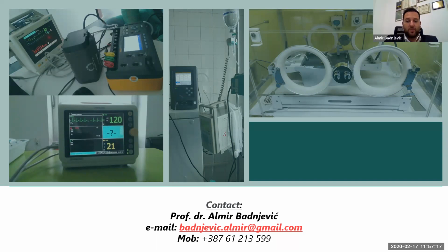Thank you for your question. Yeah. When we started developing those procedures and the bylaws, for example for ventilators and anesthesia machines, the people who were working on this checked all of those service manuals, and they said all the mechanical ventilators have flow from this range up to this range with this accuracy. All of them have volume from this range to this range with that accuracy, and they put it into the law, the bylaws and the procedure. So for each mechanical ventilator, the procedure is the same. You are measuring the volume, the pressure, the flow, the concentration of oxygen, or whatever it is. It's not important which producer it is, because the function of each mechanical ventilator is to perform mechanical ventilation for the patient.